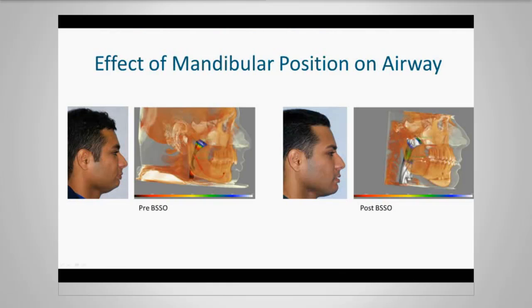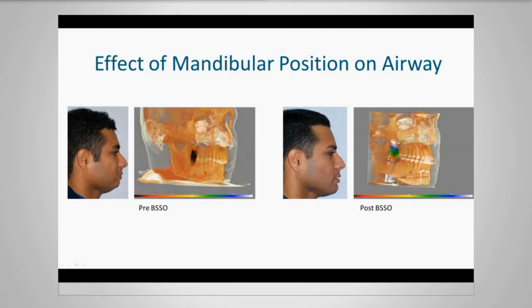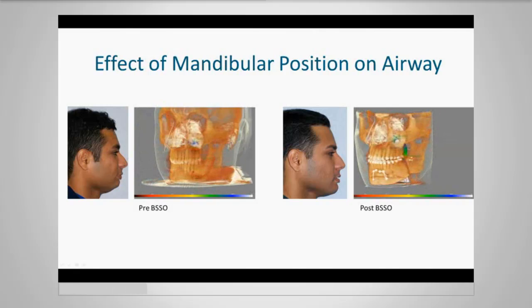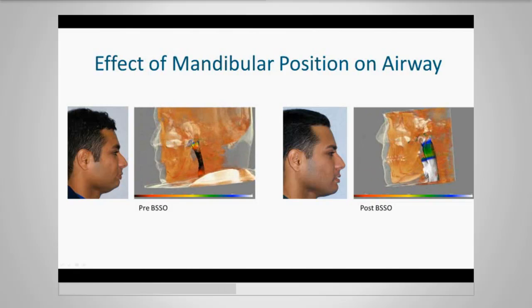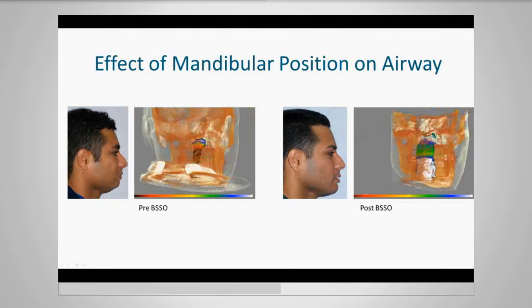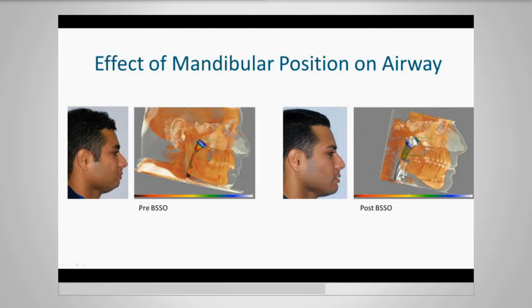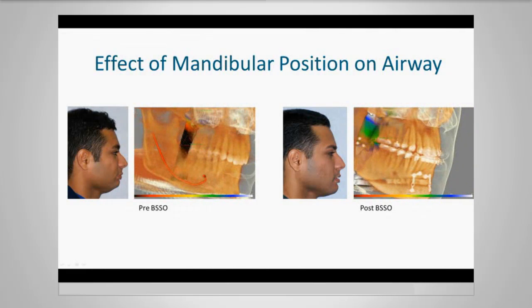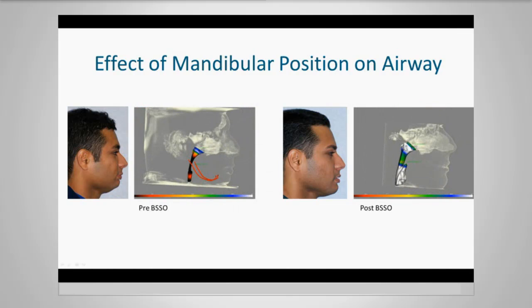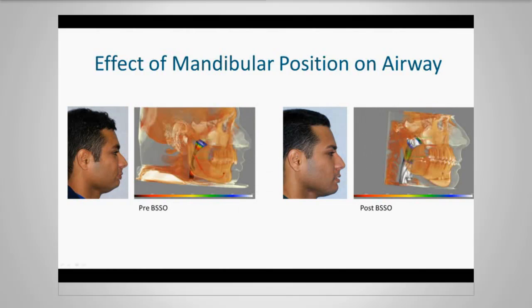Now, we did this treatment on this patient without really understanding or fully appreciating airways at the time. And just out of curiosity, I wanted to go back and look at the change of the airway. Once I was exposed to some of these articles and studies, I said, let's go back and look at the effect on the airway after we advanced the mandibles. You can see pretty significant change.